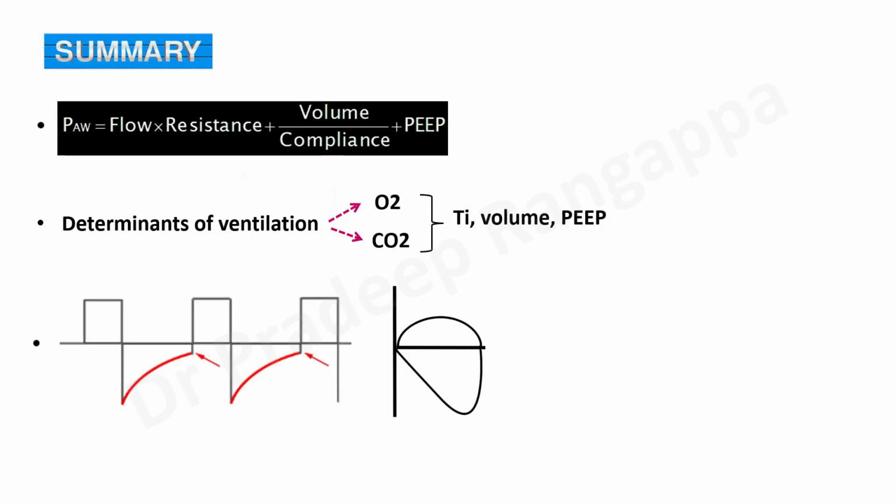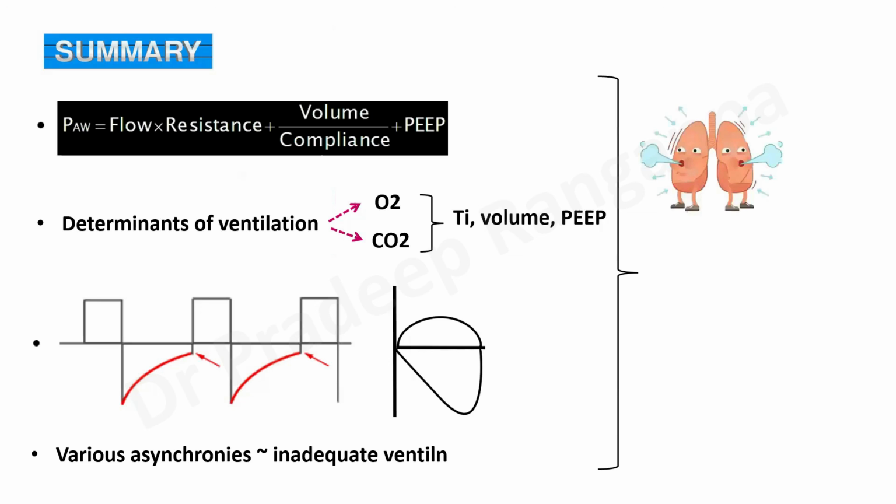And it is very important to understand all the various differential morphologies that prevail in the flow time and in the flow volume curve and its correlation with various pathologies. And it is important to understand various asynchronies that are prevailing, because the asynchrony or dyssynchrony is what will identify your inadequate ventilation. And as you see with the AI algorithms, it is shown that 50% of the time, some of the breaths that we believe are adequate, there may be elements of asynchrony and dyssynchrony that may be prevailing. And this is what AI has shown. And BetterCare is the algorithm that is incorporated to improve these dyssynchronies.